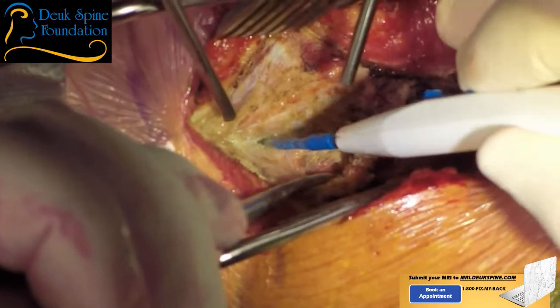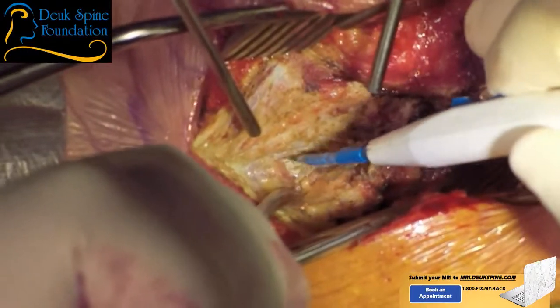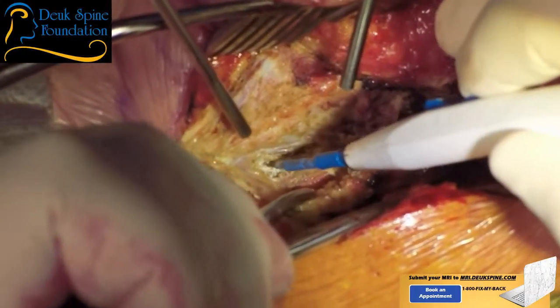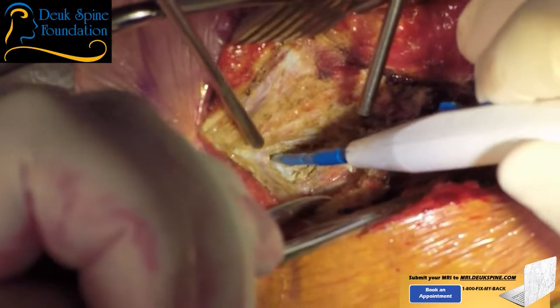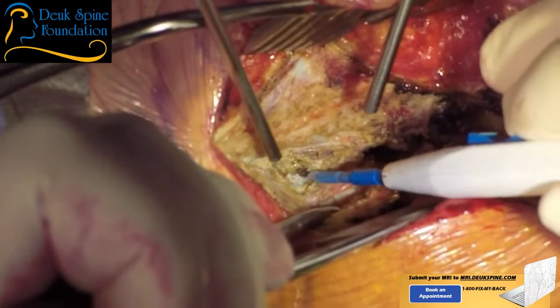So I'm in an avascular fascial layer between the muscles right now. And I'm seeing the spinous processes. I'm staying right on top of them. Remember, I'm going to go north until I find C2. Now, C2 is much bigger than C3 and C4 and C5. The spinous process of C2 is much bigger.